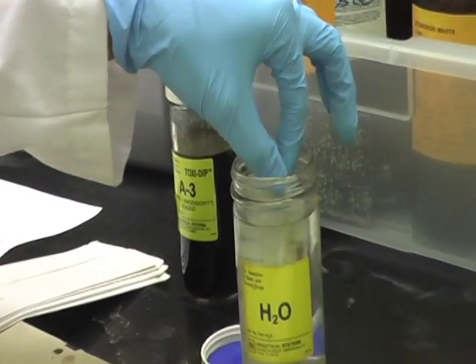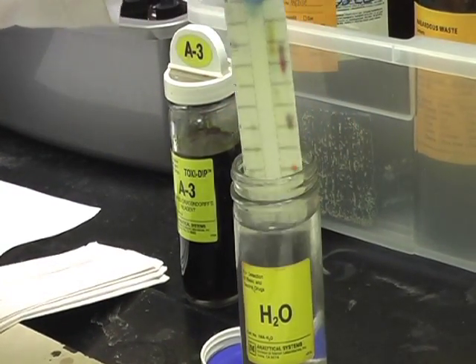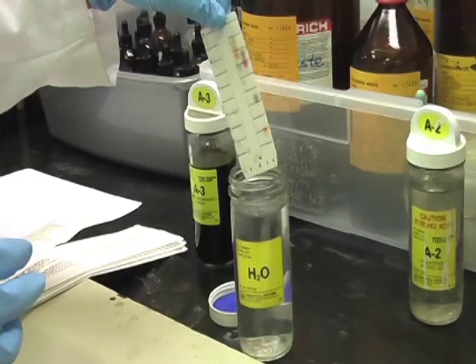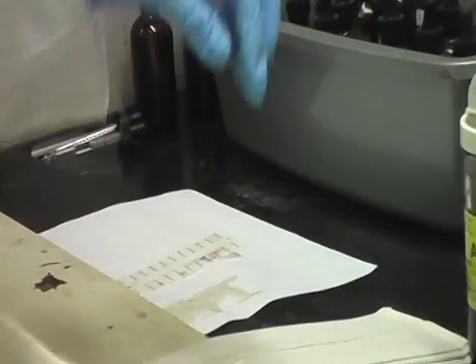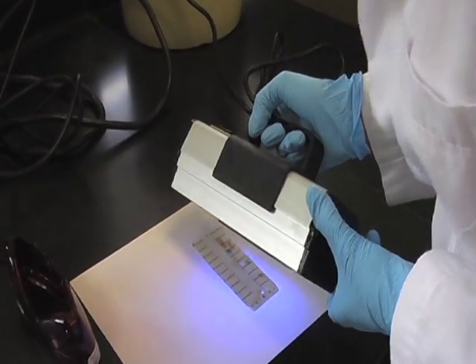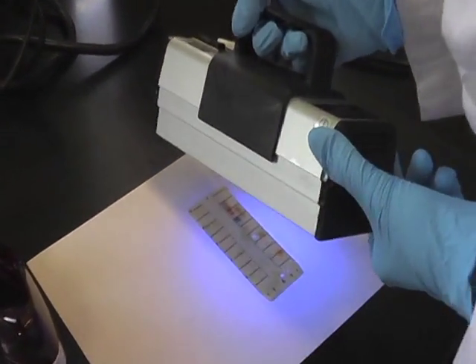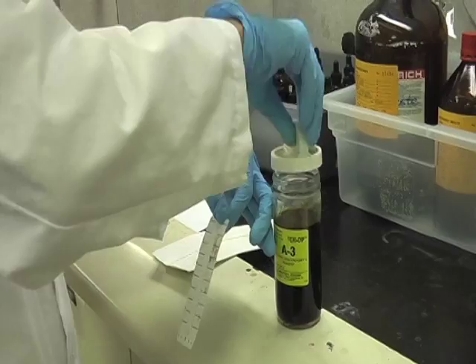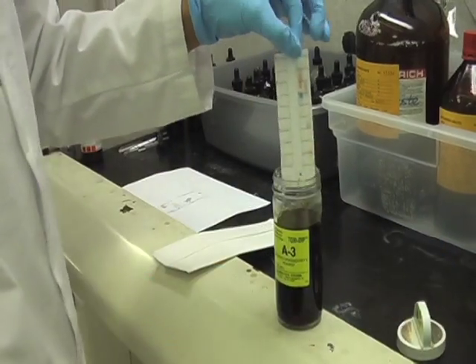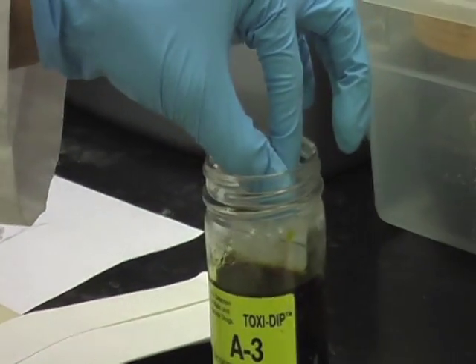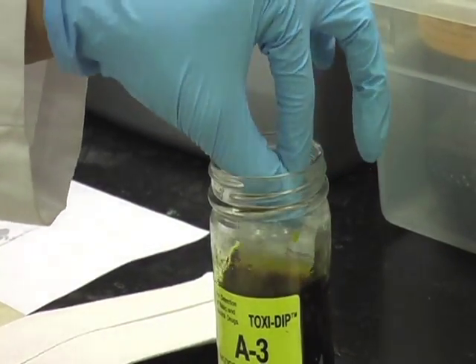Now dip the Toxigram into and out of water so that you can bring out the colors. Now view the Toxigram under a UV light to see if any of the compounds fluoresce. Next, you're going to dip the Toxigram into and out of the Toxi-Dip A-3 for approximately 10 seconds.